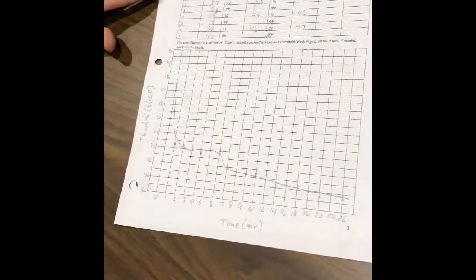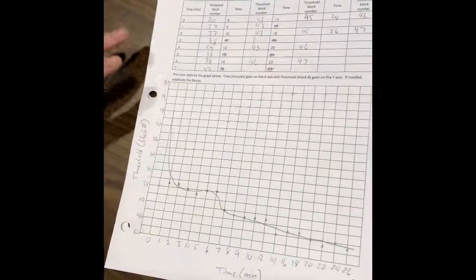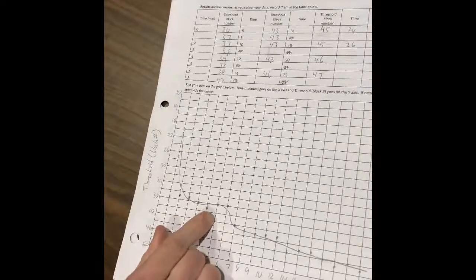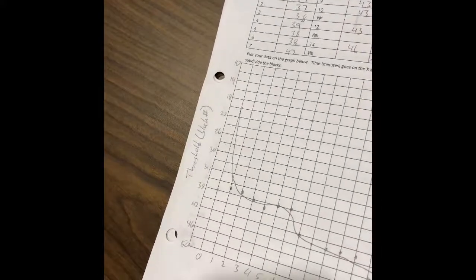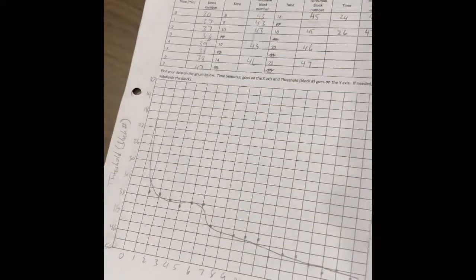Okay, so here's an example of data plotted throughout the 30 minutes in the dark, and increasing sensitivity. So a few things to notice is first you see a major drop-off as the photoreceptors are adapting to the dark. And this first plateau here is actually cone adaptation, or when the cones reach maximum sensitivity. This happens before rods reach maximum sensitivity due to the physiology of the photoreceptors. So at about 5 minutes here, this plateau, the cones have reached maximum sensitivity in the dark.